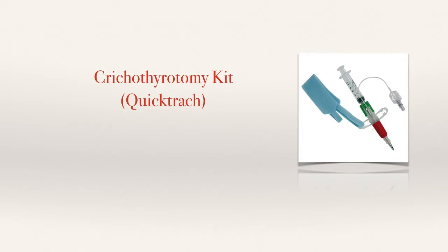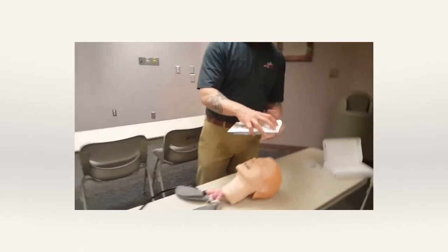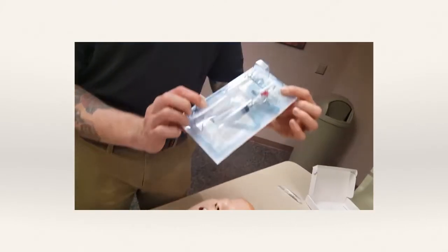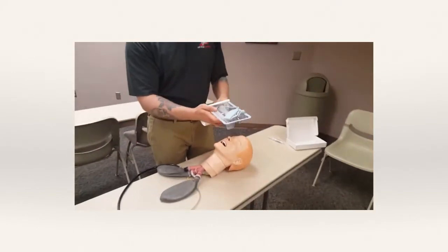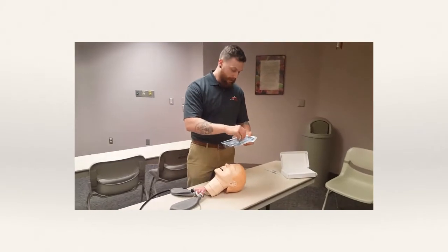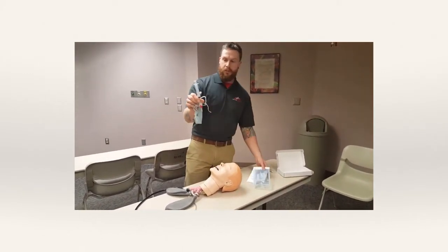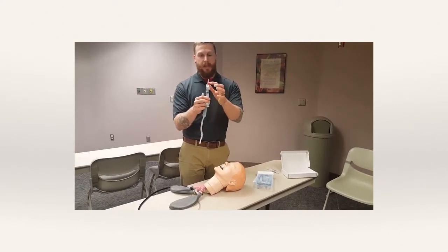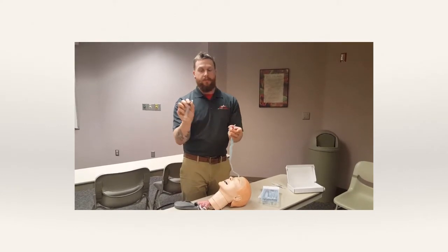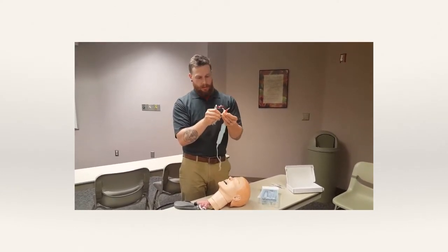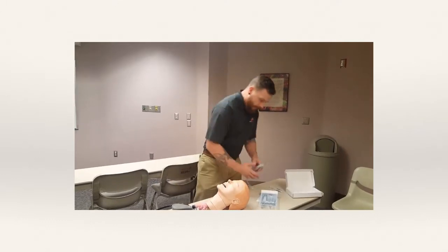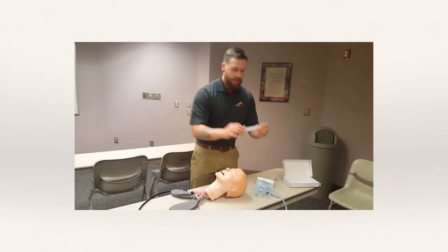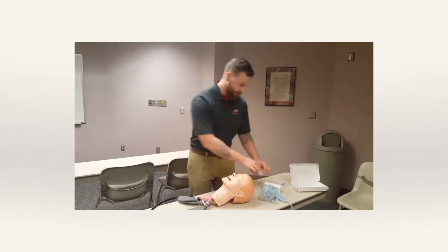The kit comes with everything you need to do the procedure. Inside you'll have the actual syringe attached to the QuickTrach, a little plastic stop device, and a 14-gauge introducer needle that comes pre-inserted into it. It also comes with a flexible extension that you'll put on afterwards.